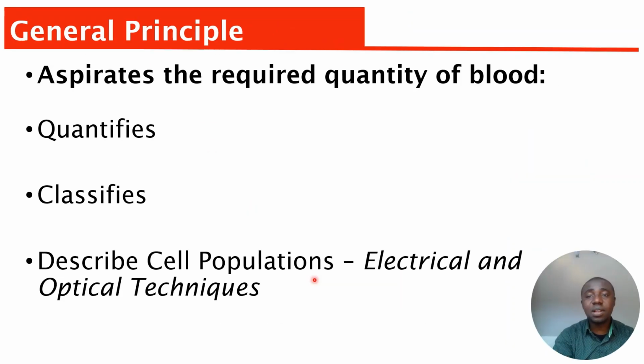Okay, let's look at the video that I want to show you, which will give you an idea about the aspiration and the dilution, what happens in terms of the cells passing through the aperture, and how light passes through it for the measurement to occur.